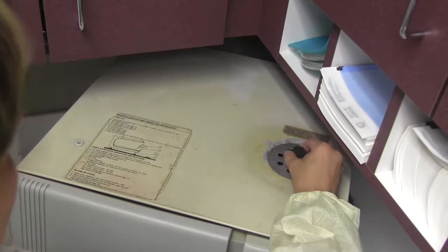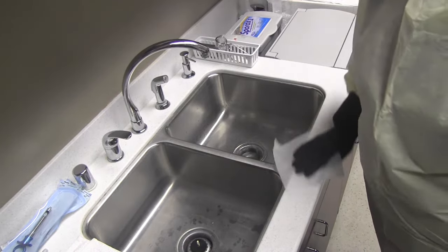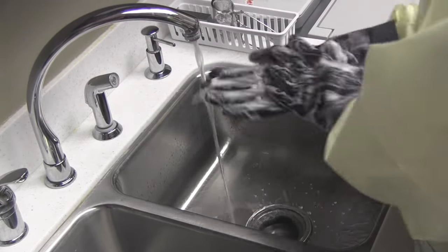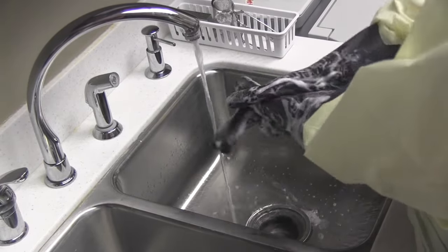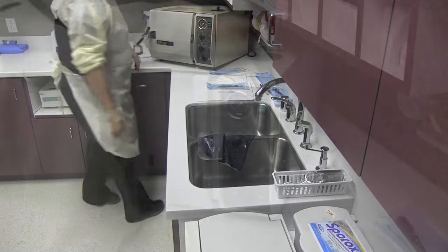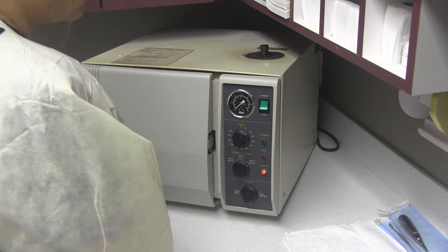Check and fill the fluid line with distilled water. Clean the sink with a disinfectant wipe. Wash the utility gloves, towel them dry, and place them in the designated area. Wash and dry your hands, then shut the autoclave door. Run the autoclave cycle according to the manufacturer's recommendations.